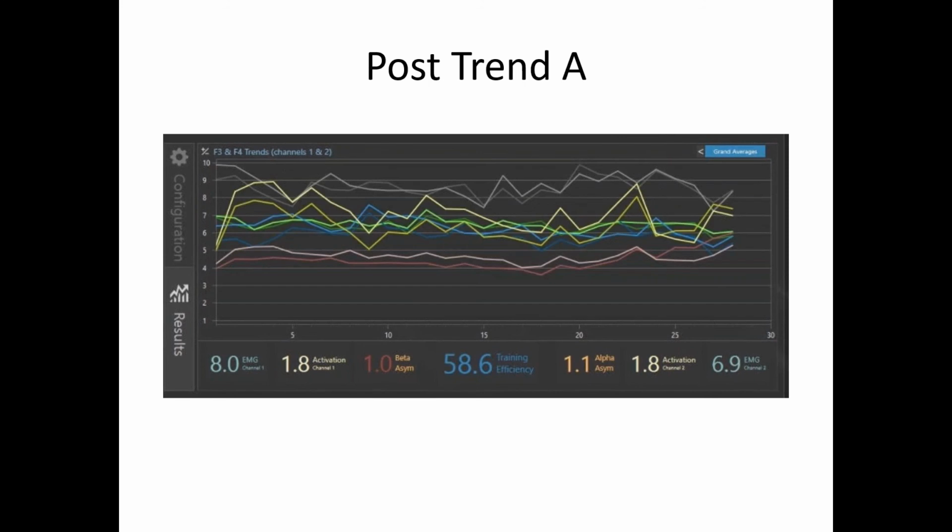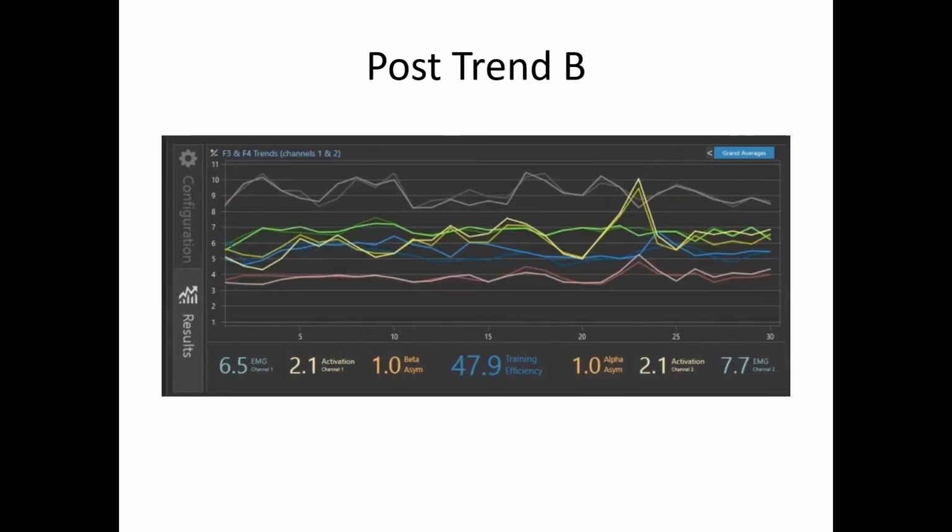So you go, let me go to that other corner and pull on that. And that other corner looks like that and you pull that one, but you can't get any better. So, well, let me go to the third corner and pull on that. And that one's looking like that. So, well, that's not as bad as the two. Let me go and pull that. Oh, that looks good. Wow, that sheet's starting to look flatter. So you have all these vector solutions that are normalizing.